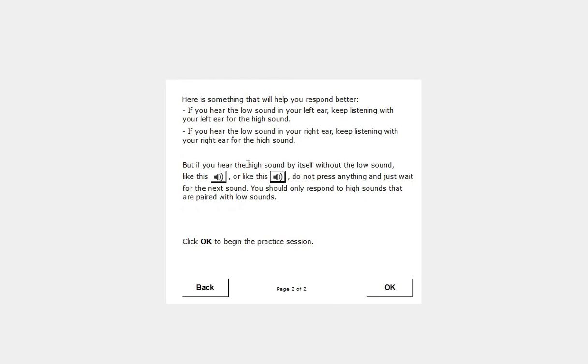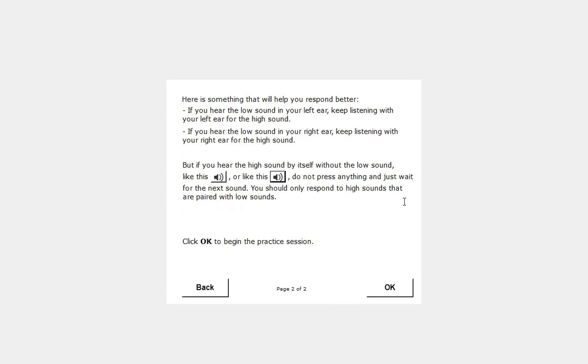But if you hear the high sound by itself without the low sound like this, or like this, do not press anything and just wait for the next sound. You should only respond to high sounds that are paired with low sounds. Click OK to begin the practice session.